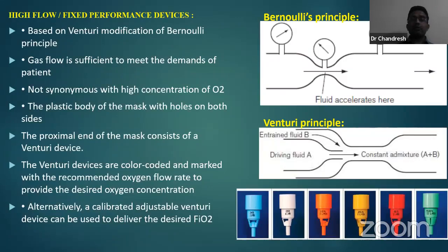Okay, let's talk about the high flow devices. It starts with one basic principle. You might have heard about the Bernoulli principle. This principle in physics is basically meant for fluid flow. Whenever fluid passes through a narrowing, and if the pressure drops, there is definitely a flow increase, or maybe the fluid accelerates here.